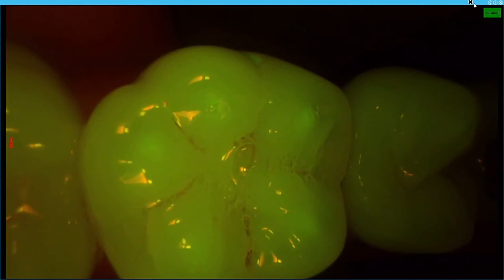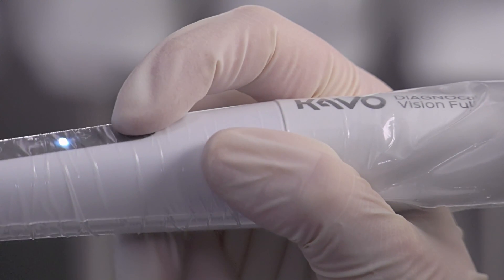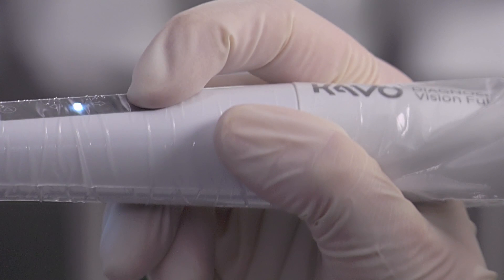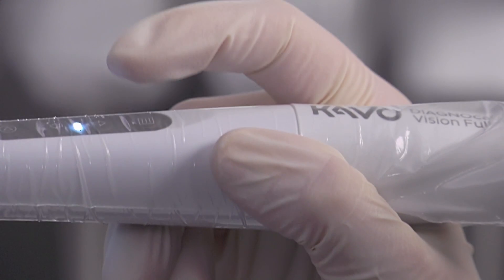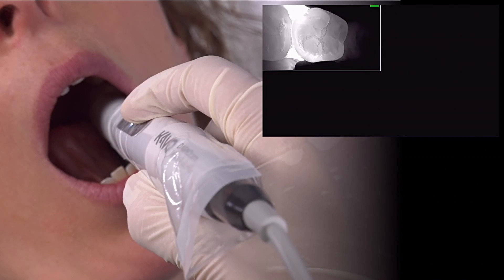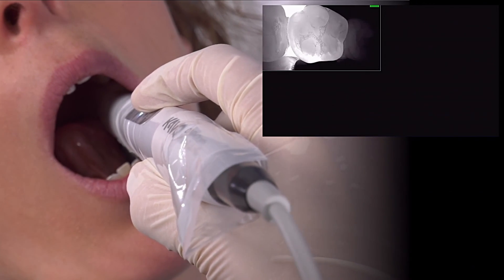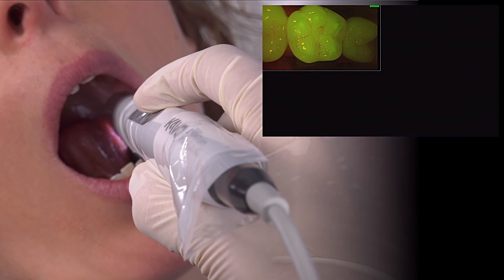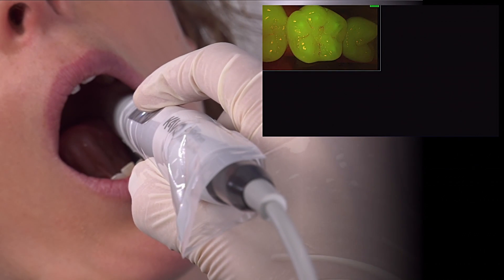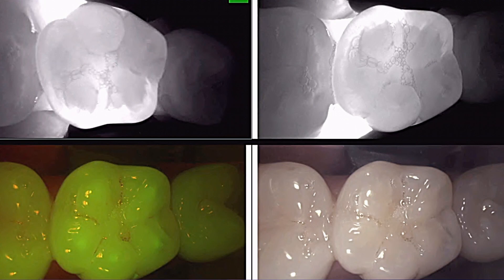If you would like to switch to multi-shot mode in order to take a 3-in-1 or 2-in-1 picture, press and hold the menu button. The multi-shot feature is then displayed on the screen after it has been triggered and supports patient communication.